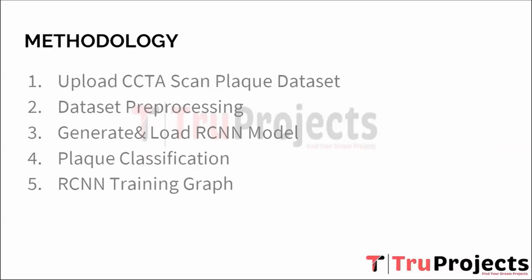Third, generate and load RCNN model. Once the dataset is preprocessed, the next step is to generate and load the RCNN, that is recurrent convolutional neural network model. The RCNN model is a type of deep learning architecture that combines the power of both convolutional neural networks, that is CNNs, for image feature extraction, and recurrent neural networks, that is RNNs, for temporal analysis. This unique combination allows the model to analyze sequences of images over time, making it particularly well suited for tasks like plaque classification in CCTA scan.